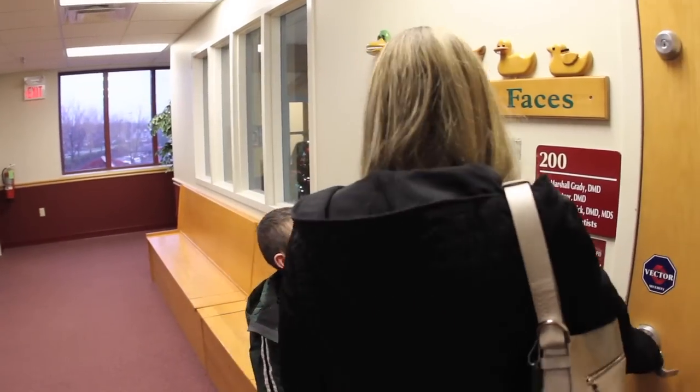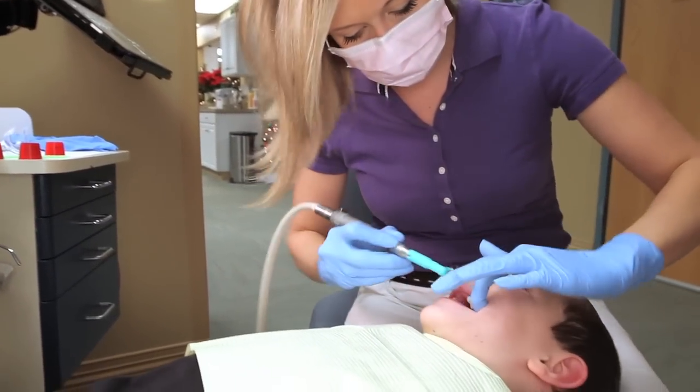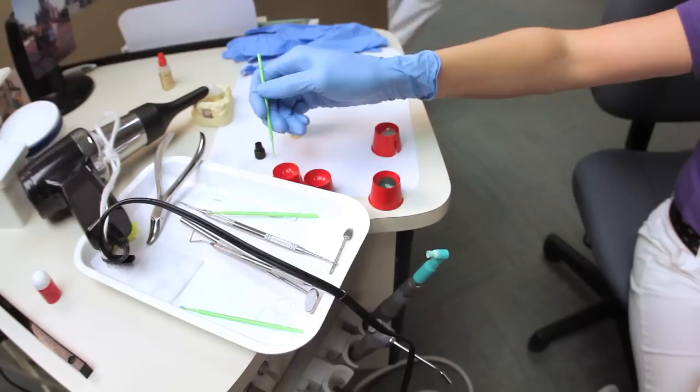When you come in for the expander insertion appointment, the patient manager is first going to clean the teeth with pumice. This is just a gentle wheel to clean all of the plaque and food debris off of the teeth.